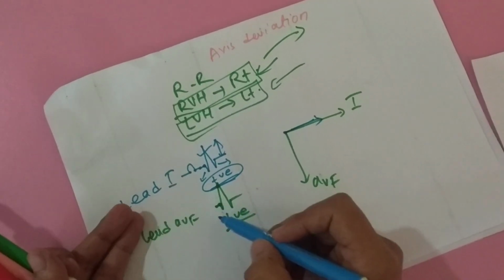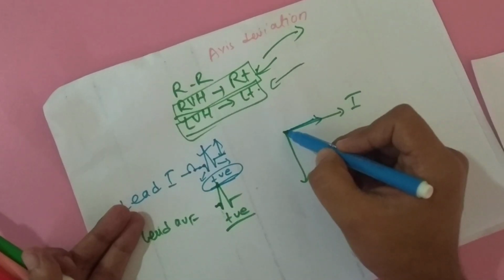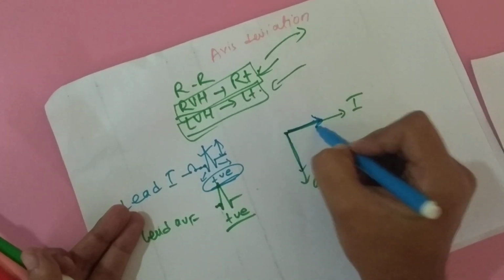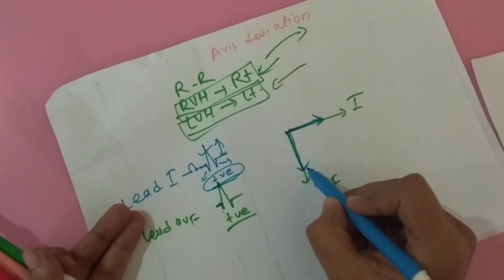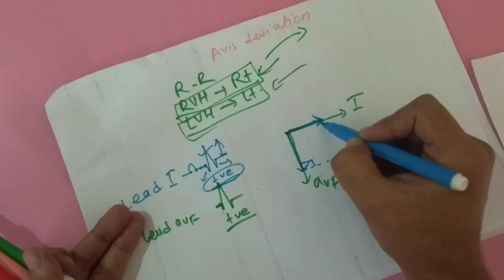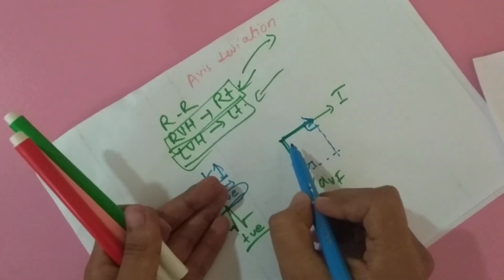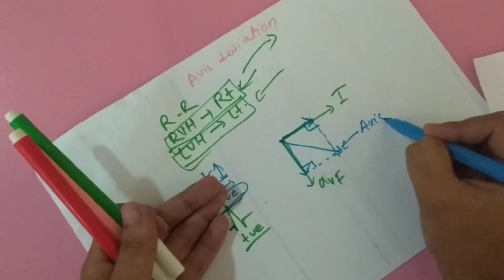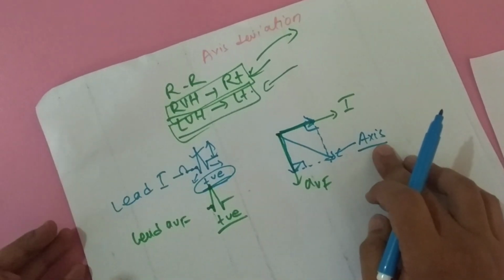And in case of lead AVF, suppose let's say 4.5, and I draw a vector till here. So this is the magnitude I have in lead 1 and this is the magnitude I have in AVF. And now what I do is I draw a perpendicular line to them. So this is one perpendicular line and another perpendicular line, and when I make a resultant vector in it, this is the axis of that QRS complex. So this way I find the axis of the given ECG.